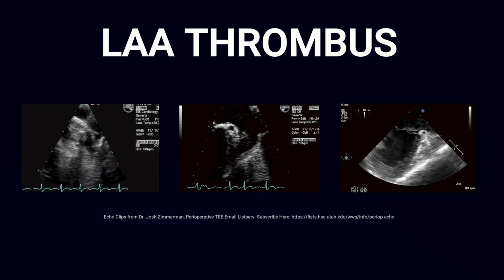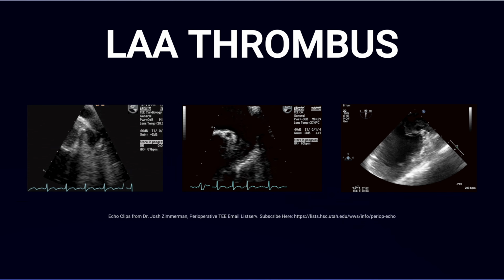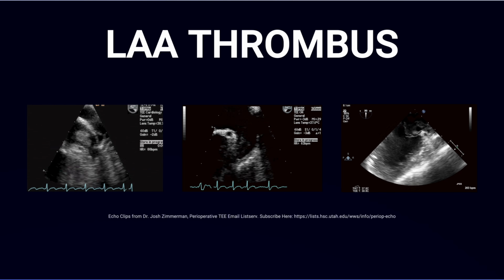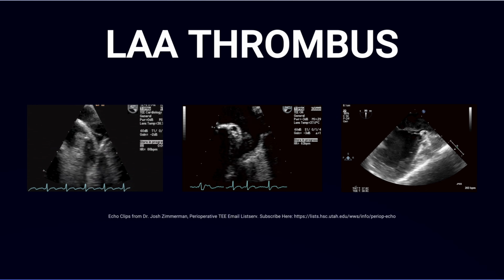The characteristics that you will see if you're trying to observe thrombus are that it originates from the left atrial appendage, it's homogeneous, it's not attached exclusively to a valve like the mitral valve or the interatrial septum, and that it doesn't act like an artifact.